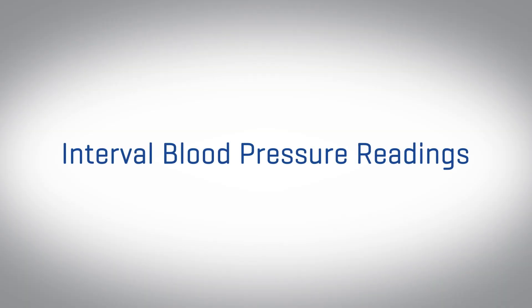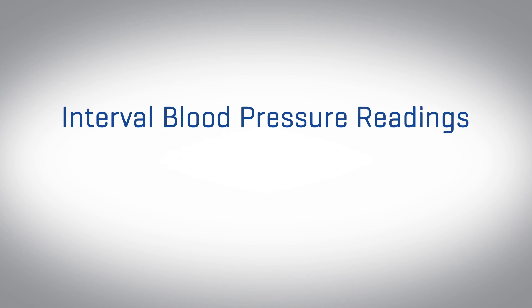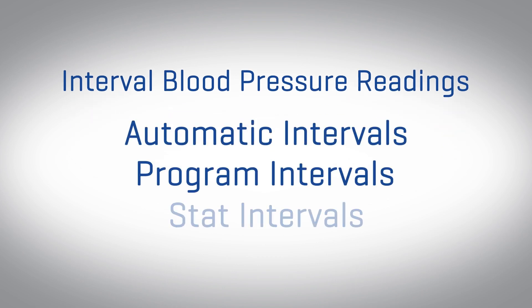Now let's review interval blood pressure readings available on the Connex family of devices. There are three different types of intervals available: automatic, program, and stat.